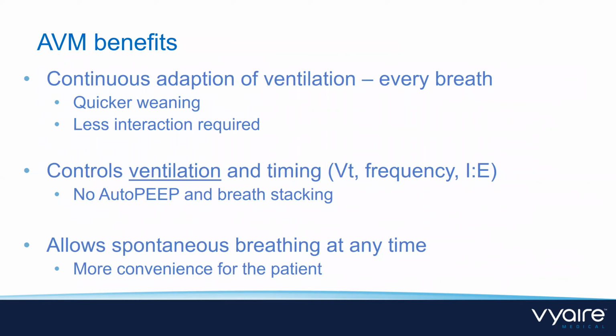But we have now determined the optimal rate. We have now the optimal target and tidal volume. And there need to be some more measures to keep this type of ventilation even more safe. And these are the lung protective rules.